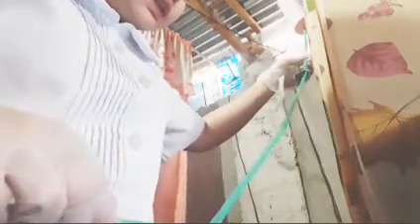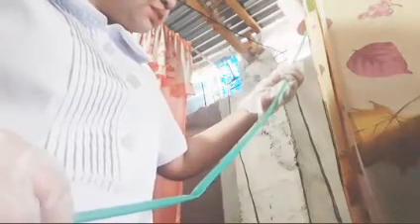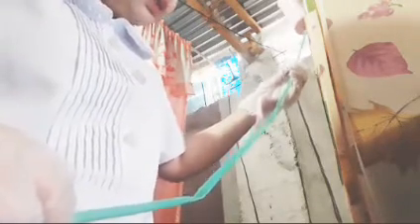And release the clamp slowly. So here's the roller clamp. And let the fluid run through the tubing until the bubbles are removed. And then reclamp the tubing, replace the cap, and check the appearance of the infusion site. Ensure that the correct type of fluid is being infused, and then the rate of flow, and the response of the client to the solution.